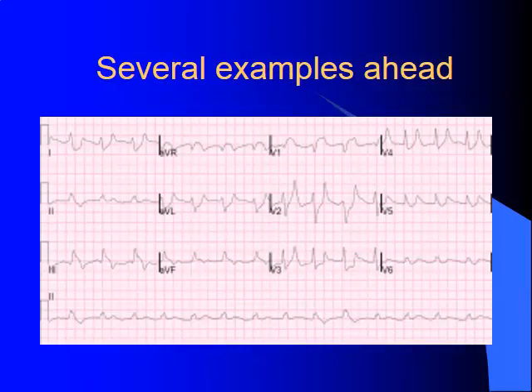All right, so in our example here, we want to find our most equiphasic lead. This is somewhat difficult to determine here, but it appears that our most equiphasic lead is going to be lead 1. Lead 1 runs perpendicular with AVF. We look at AVF, and our complexes in AVF are mostly positive, so our axis is 90 degrees. This is a normal axis, and definitely a normal EKG.